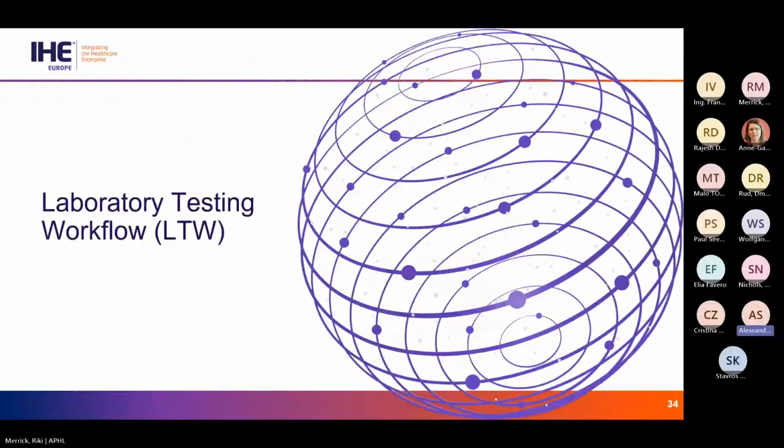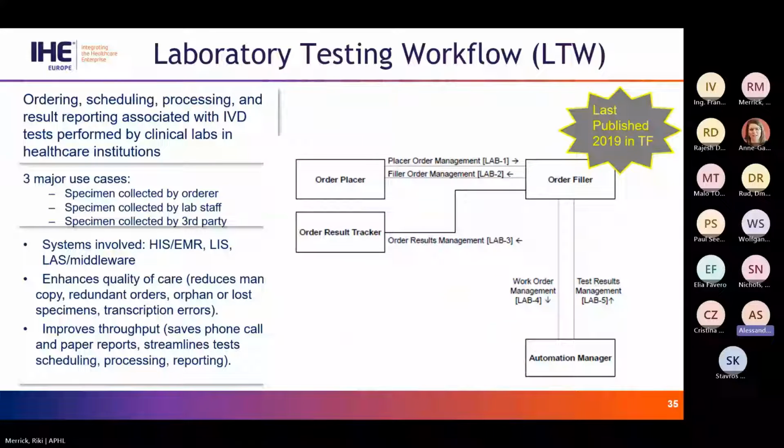So now also a few words about two hot profiles, we can say, at the connectathon, and we have Laboratory Testing Workflow first. And I think that it's one of the profiles that has been tested more in the past connectathons, as it involves, we can say, the first part of the overall laboratory process.